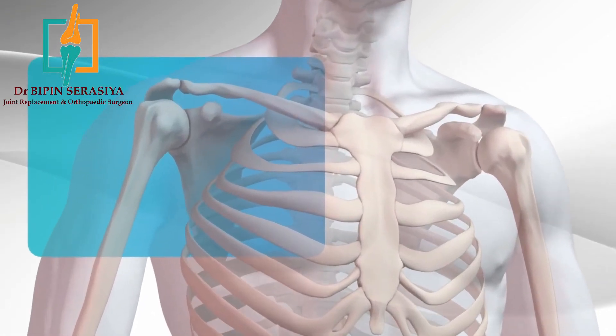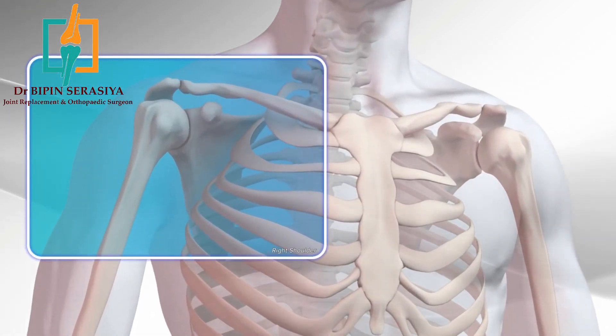In this video, we will demonstrate a reverse total shoulder replacement for rotator cuff failure with wear and tear arthritis using a reverse shoulder replacement system.